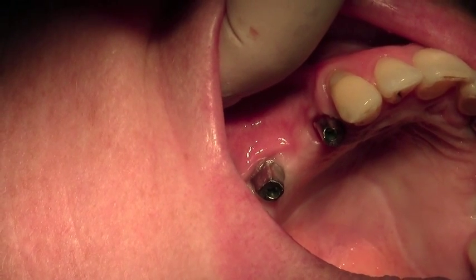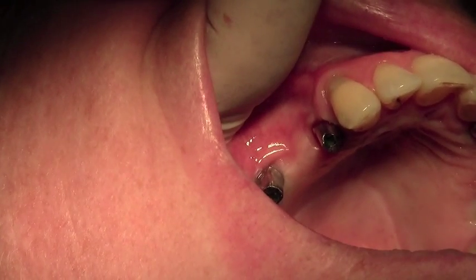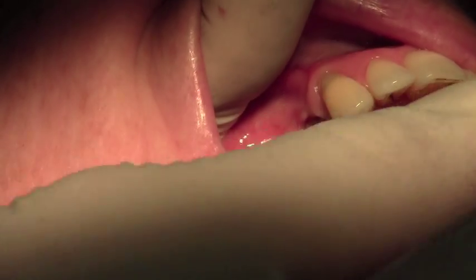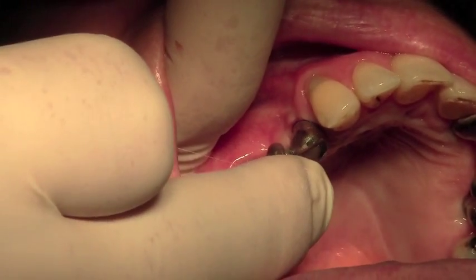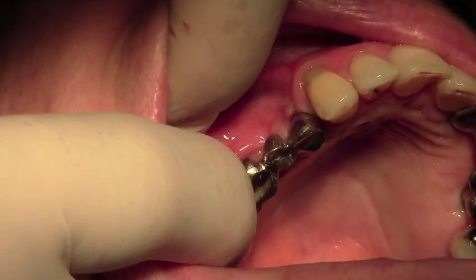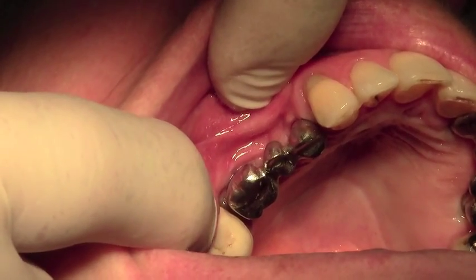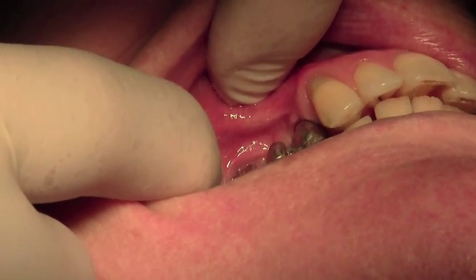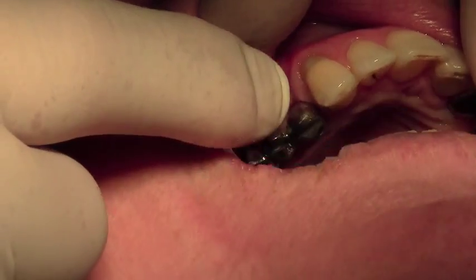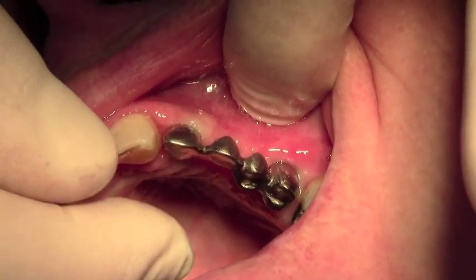We're going to get the metal substructure next and try that in place. Here's the metal substructure for the three-unit bridge, and I'm going to just try that in — what we're looking for is checking that the abutments are on correctly and that this has passive fit. Push it all the way down, and that is fitting down absolutely beautifully. The next thing we'd want to check is whether we've got enough occlusal clearance for the technician to finish the porcelain, so I'll ask our patient to bite together — and that looks absolutely fine. You can see here's the bridgework on the other side, which we've already tried in place. Those are the CAD-CAM abutments in situ in the lateral incisor and molar position.